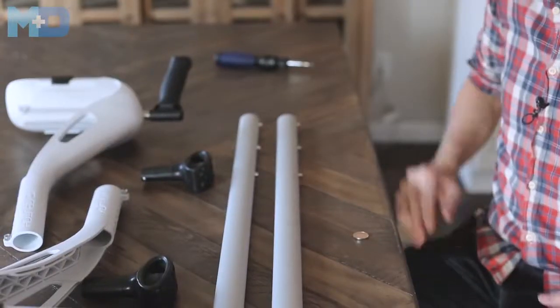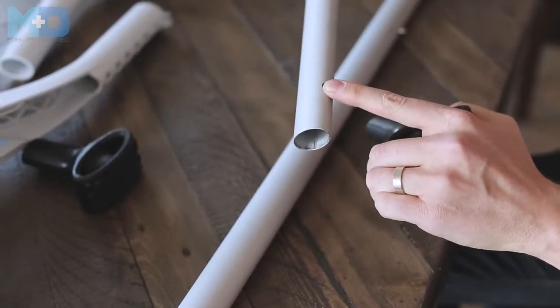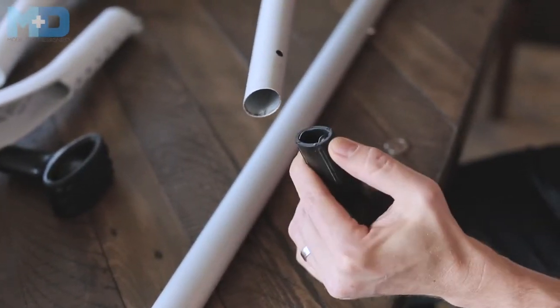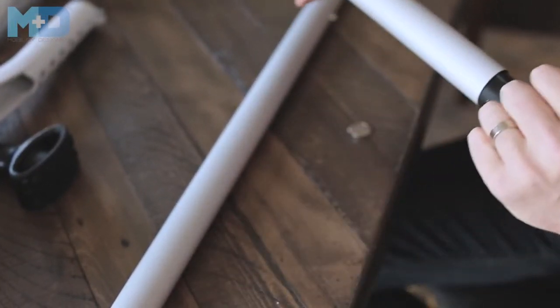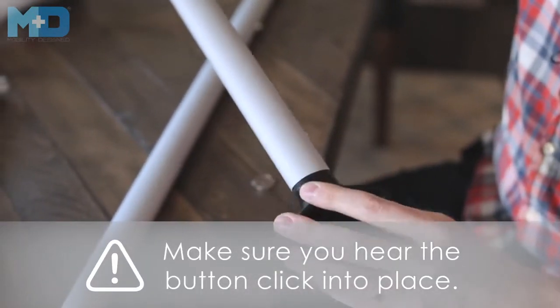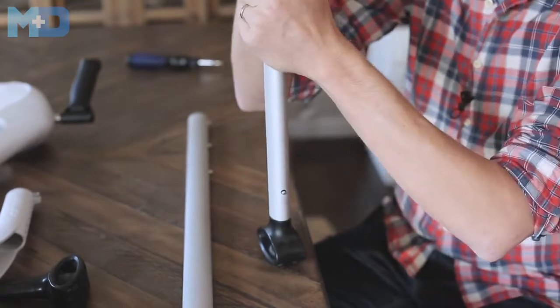The first thing that you're going to do is assemble the feet into the crutch legs. On the back of the crutch leg, there's a hole that aligns perfectly with the snap button on the foot. So when you're inserting the snap button on the foot, all you have to do is depress the button and insert into the leg, like so, and then push it together until you hear an audible click. We designed it to be tight so that it won't rattle. If it's too tight for you to push in like so, you can always use a table or the ground to push it in.